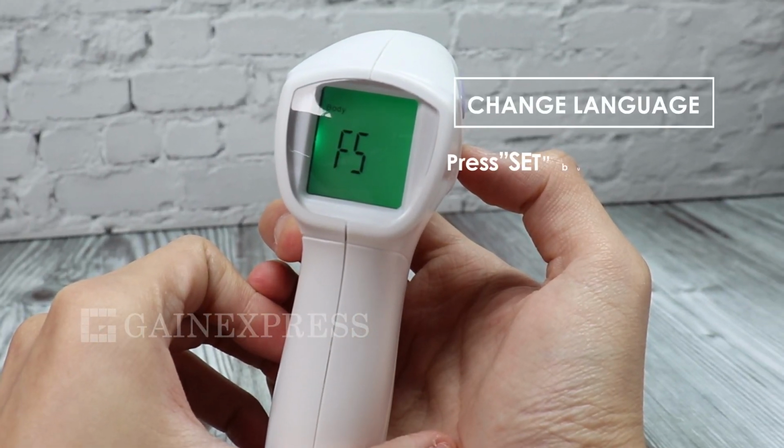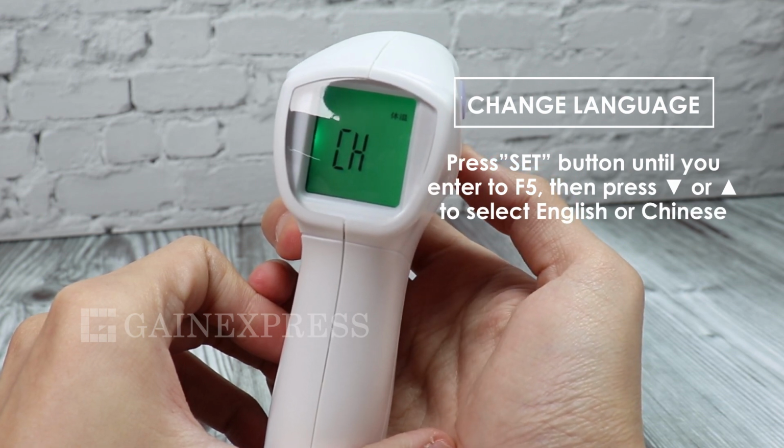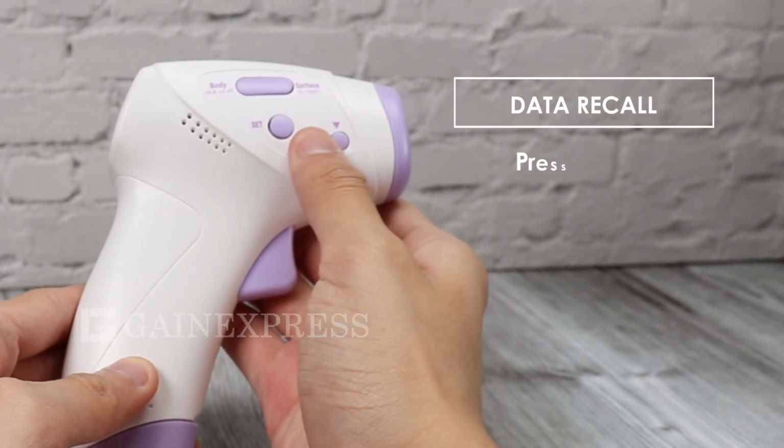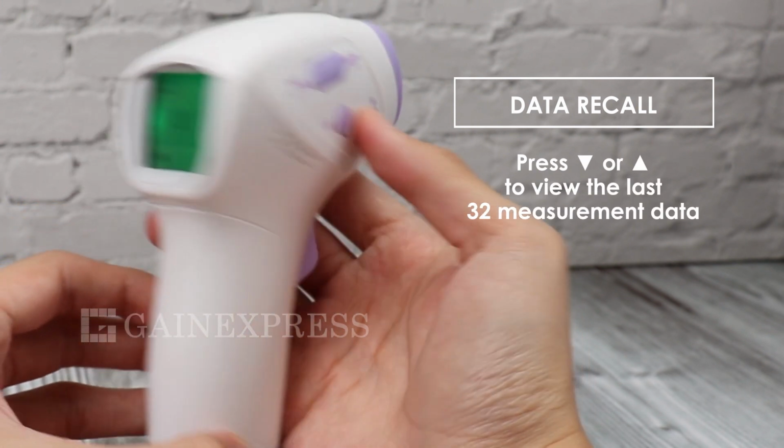Enter F5 by pressing Set button. Then press up and down to select English or Chinese language. To view the stored data, press the up and down button. You can store up to 32 measurement data.